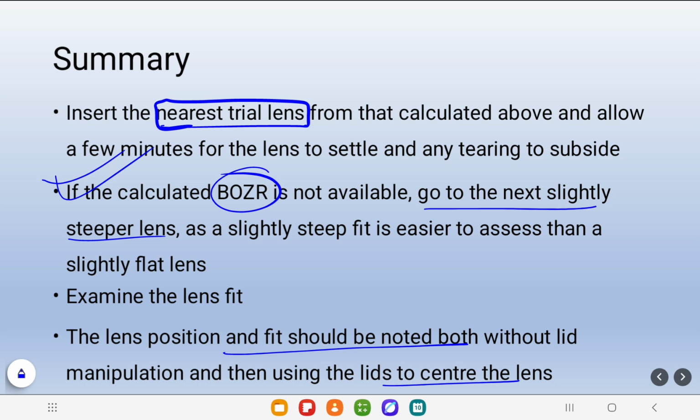One, you let the contact lens be influenced by the upper lid, definitely by both lids, and you will also examine by separating both lids, with the contact lens alone on the cornea. That's the better way. You will do both ways.